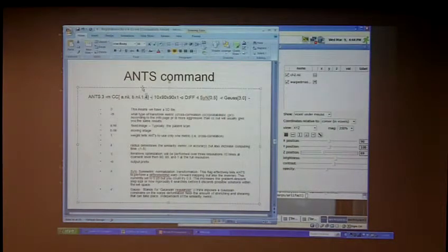And it could look bad on a case-by-case basis. You might have to do these tweaks case by case, just by virtue of the peculiar nature of the signal in each person's brain. But overall, I have to say, 80% of the time, you run the script, it outputs, you look at it, and most of the time I've been happy with the outputs using the parameters that we have.